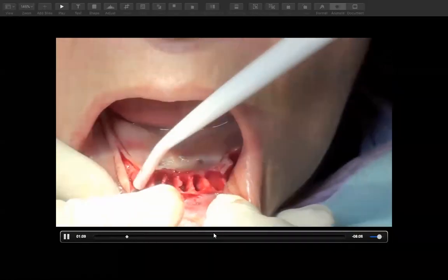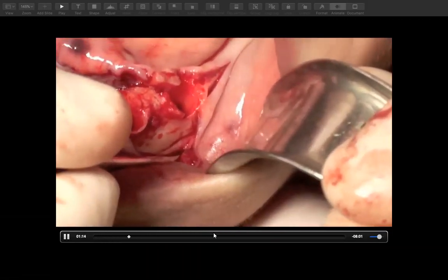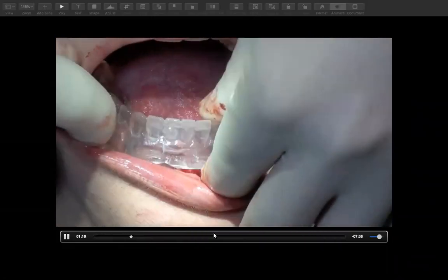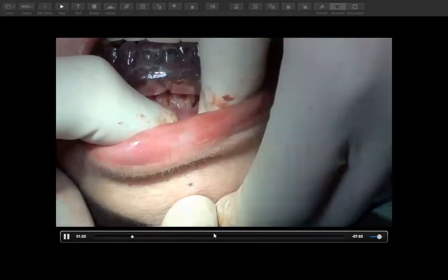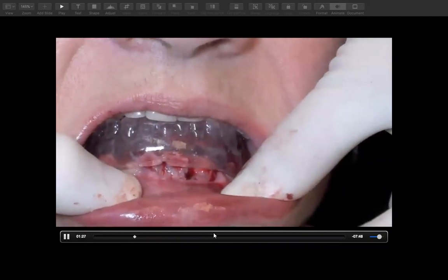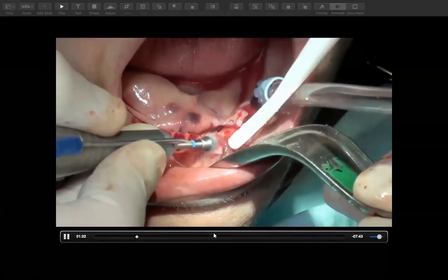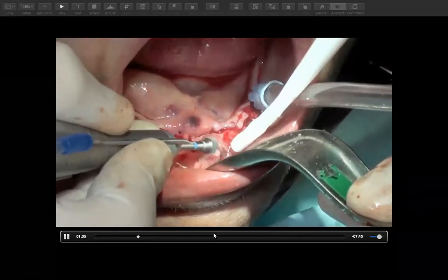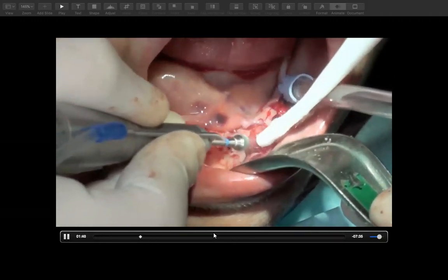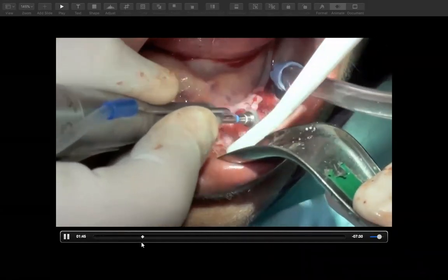The teeth have now been extracted. The tissue has been reflected, and now they're going to do some bone reduction. Alveoplasty will be done. This is the clear surgical guide that they're using, and you can see at the edge of the flange, the bone is up into the denture base, and that bone needs to be reduced level with that flange. That flange is marked 15 millimeters from the incisal edge down to the edge of that clear denture. They'll do their bone reduction here. You can see irrigating that.